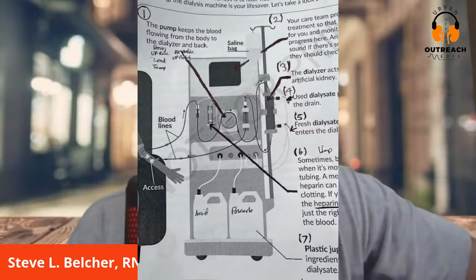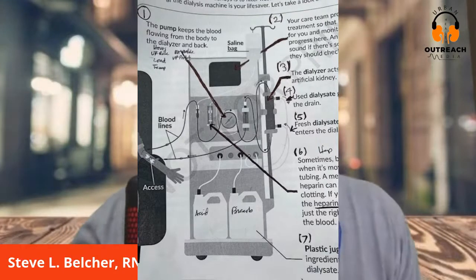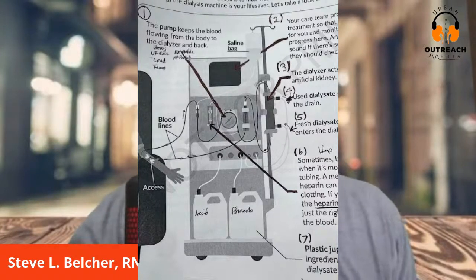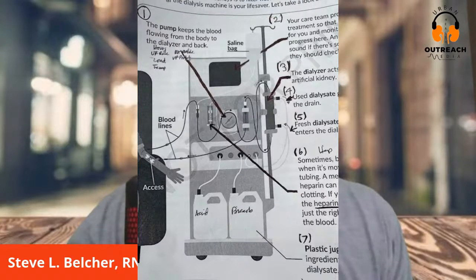All right. Now let's move down to number six. And you see where that arrow is pointing? That's pointing to a syringe called the heparin pump, right? Now each patient, then maybe it cut back on when giving heparin, and then all patients got anticoagulant, heparin, bolus. And so what would happen, once we put both needles in, we put heparin, say you get 2,000 units. We put 2,000 units in the venous line, circulating your blood, and then we initiate treatment. Well, the heparin pump, the reason for it, because sometimes blood can clot when it's moving through the tubing. And like I said, medication called heparin can keep blood from clotting, at least the right amount of heparin into the blood.